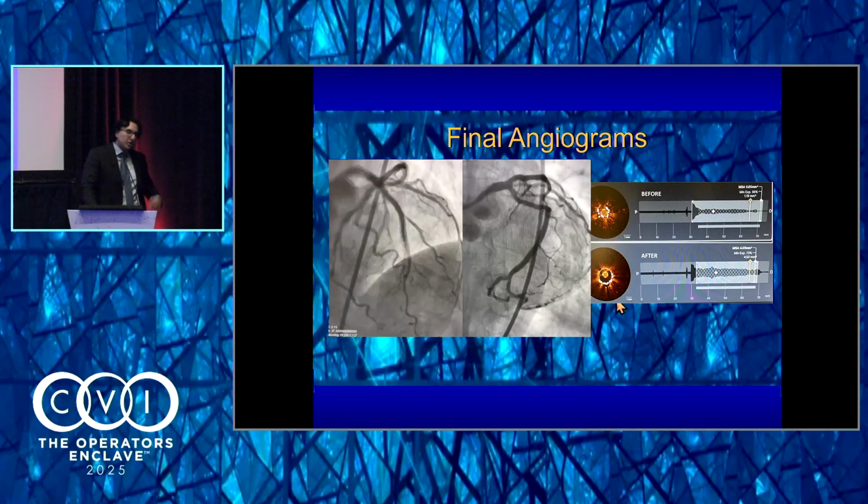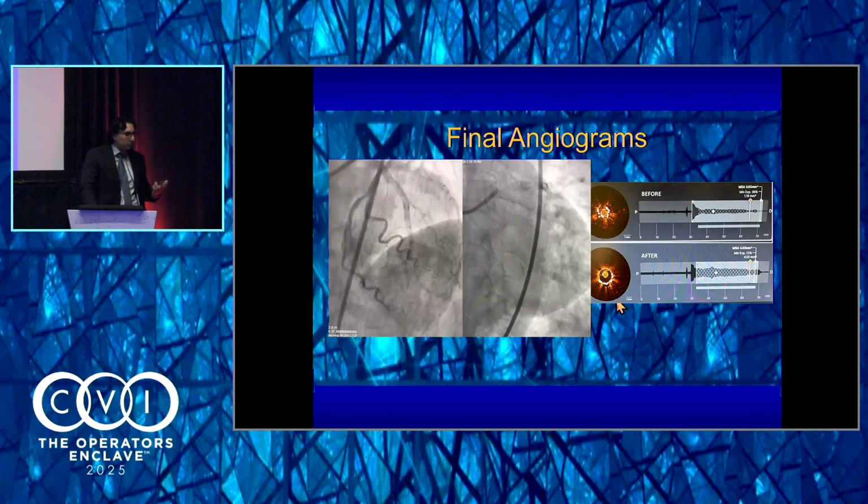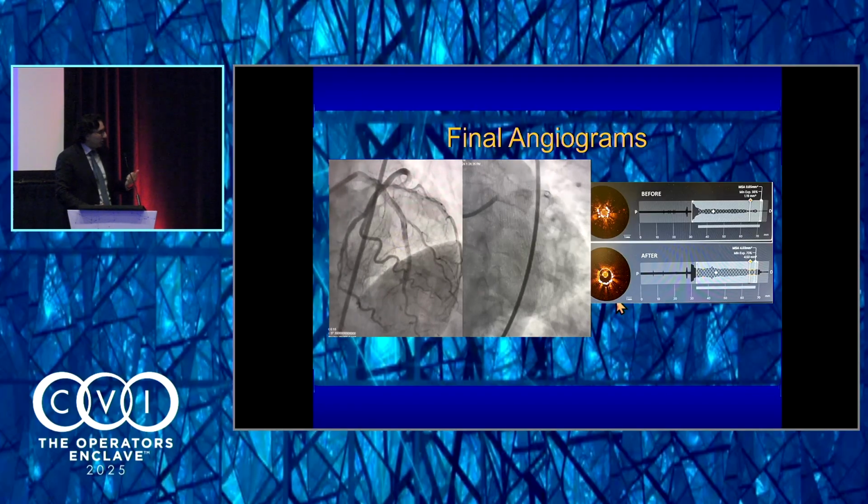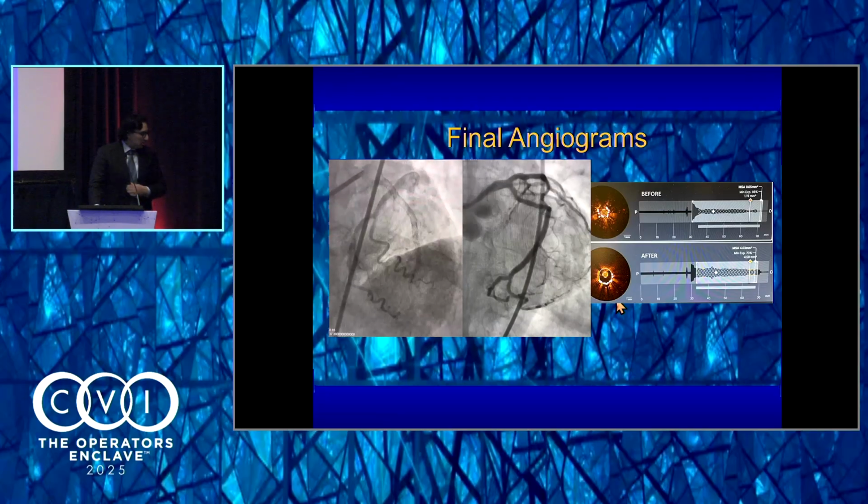And because it was under 3 layers of stent, I thought the risk of perforation, that type of thing, was very low, and that's why I sized 1:1. But normally I would go down by half a millimeter. And actually, I would argue you undersized.